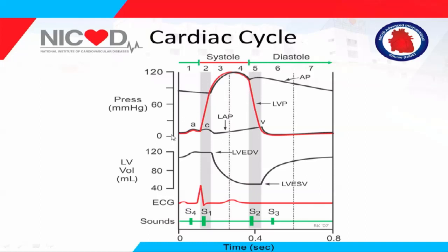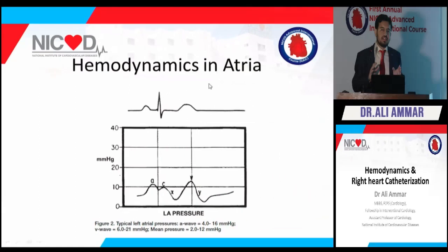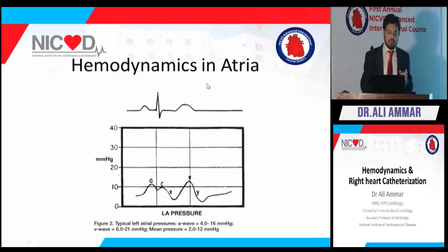See, there is a 0 point, and it is touching the 0 point. So ventricle pressures always touch the 0 point. And these are the aortic pressures. They are coming from just like 70 millimeters of mercury here on the scale, and they're going in this way. So we have to recognize the patterns. We will see the hemodynamics step by step in different chambers. This is the ECG. Remember, the ECG is a very, very fundamental tool for measuring the hemodynamics.